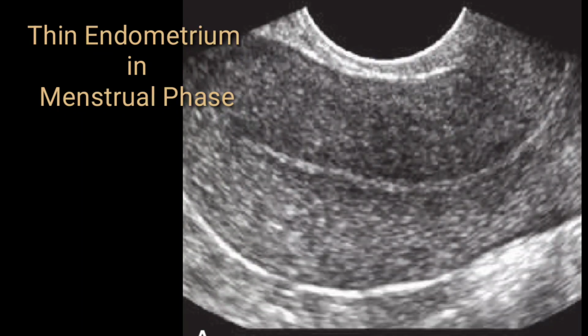Here everything is clear. It is a normal uterus with menstrual activity. The patient will give you the history, so also put on your report the last menstrual period, and then confidently mention that the endometrial thickness was 2 to 3 mm with the history of the patient being in the menstrual phase.